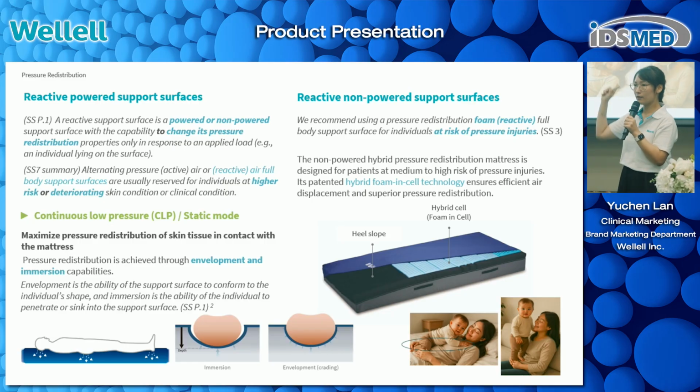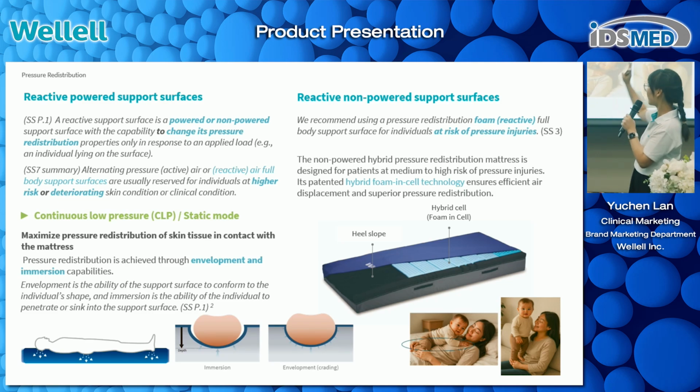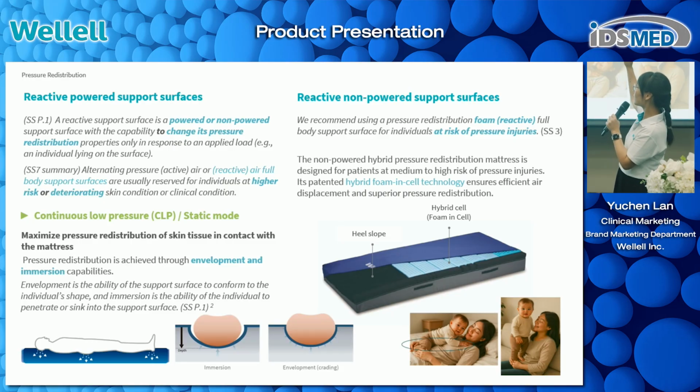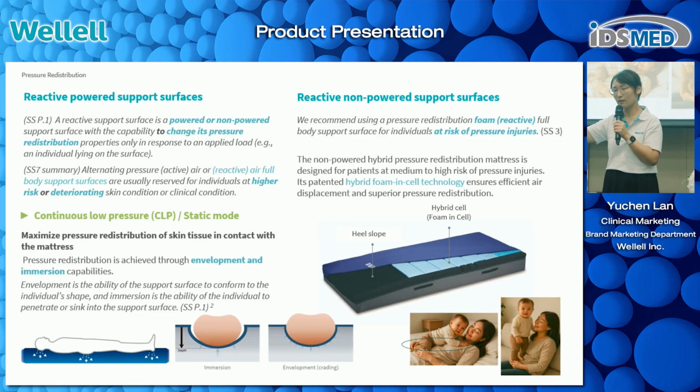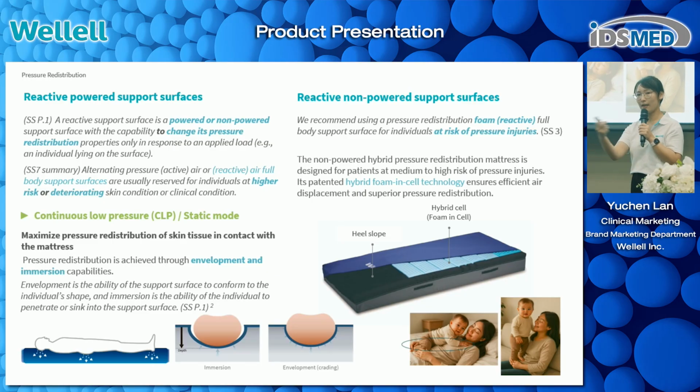For reactive support surfaces on the market, we have reactive non-powered, and also reactive but powered. For reactive powered, later you could see there is a mode called CLP, continuous low pressure, and everyone could try the function later.